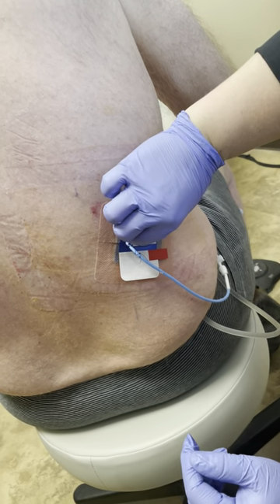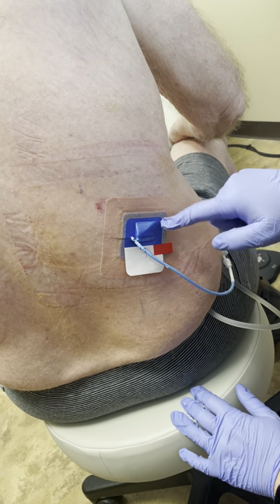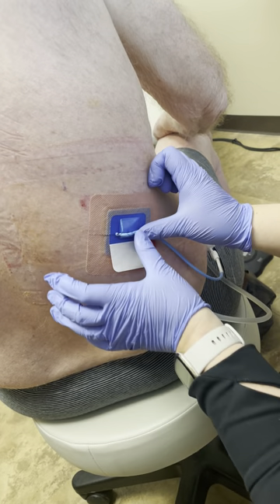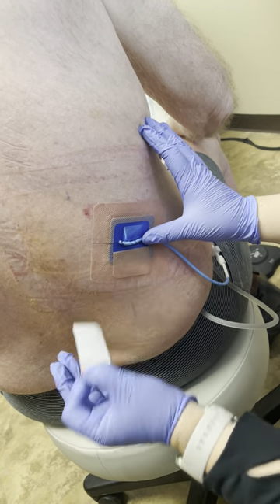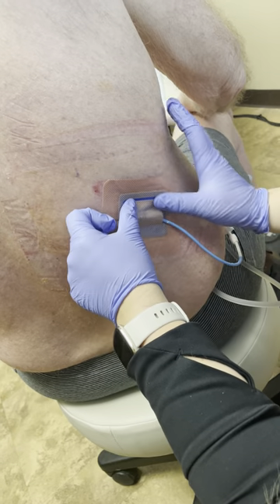Then this tab comes off first, and this is sticky on here to hold the tube. So that's sticky like that, and then this tab comes off, and this flaps over like that.